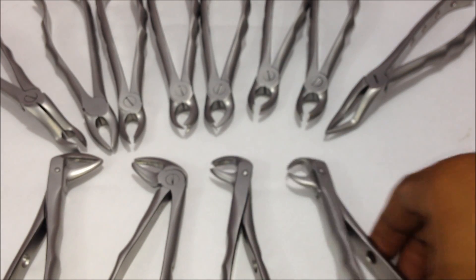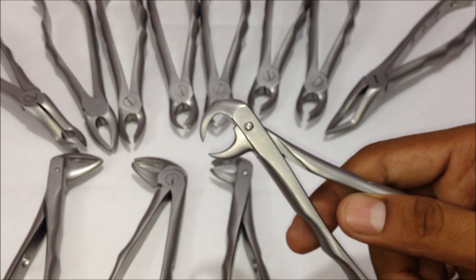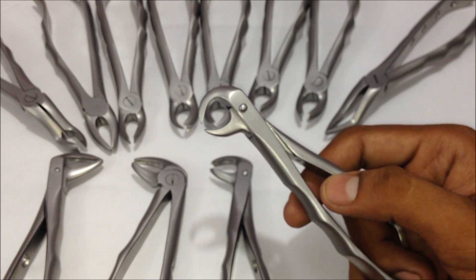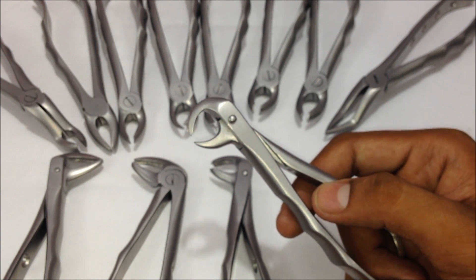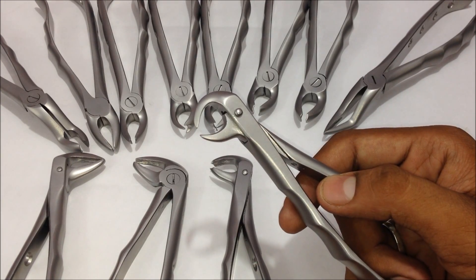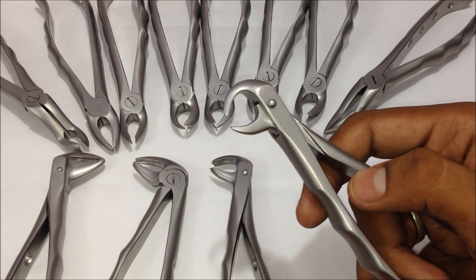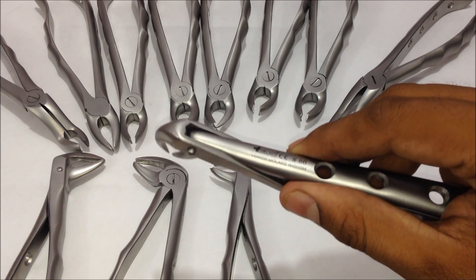The last extraction forceps is the number 86, the lower molar wisdom forceps. This is used when extracting wisdom teeth — the third molar, number eight tooth — whether it is erupting or impacted. After giving an incision, opening the area, bone sectioning, and creating proper access points, this forceps goes in, holds itself at the access points, and the tooth is pulled out.